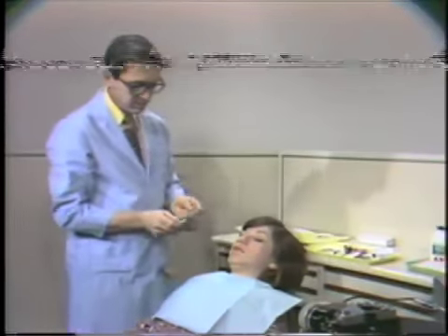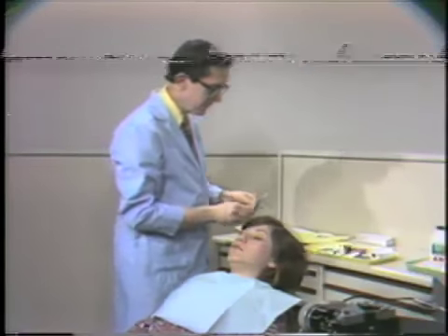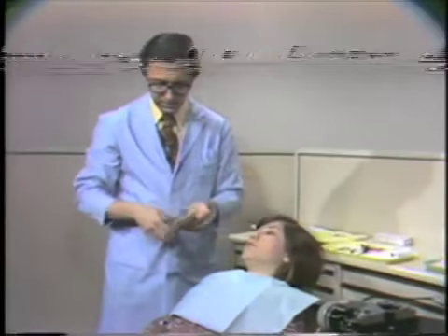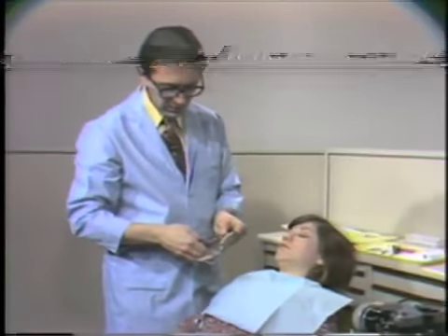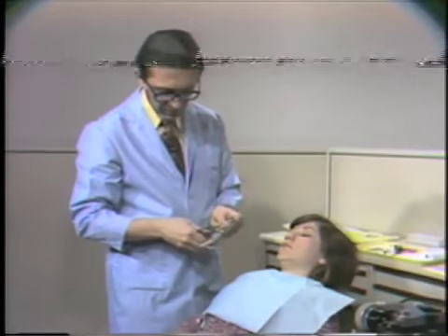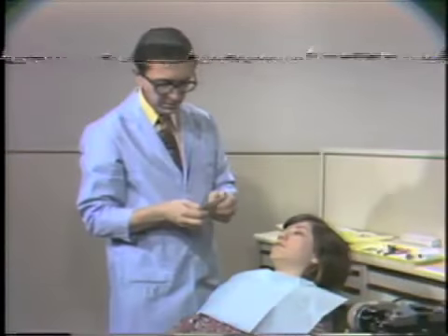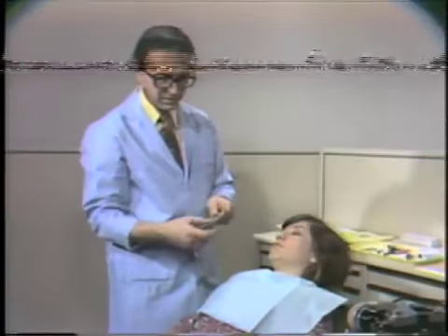We'll get our rubber dam prepared. Usually what I recommend is placing 8 holes in the rubber dam, the smallest holes possible. Since we're going to be doing 6 anterior teeth, we'll usually make 8 holes in the rubber dam. 2 holes will be for the bicuspids. 6, 7, 8. And these holes are all widely spaced such that we have an area to protect the gingiva.